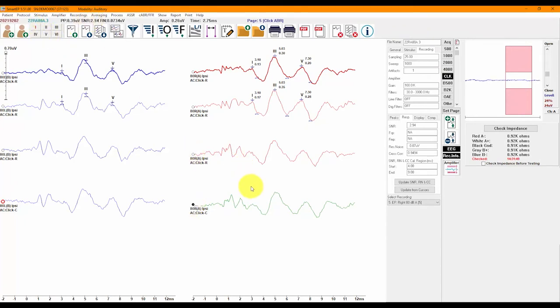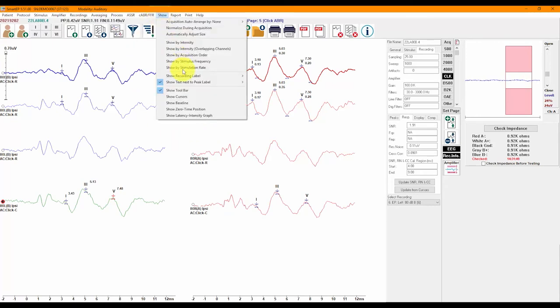When testing infants, it is not uncommon to test one ear first going through all frequencies, then proceeding to the other ear. Using this feature, you can easily move the right ear recordings to the corresponding pages first, then switch to the left ear and send those recordings to their pages. You will have the recordings arranged with the right ear recordings on one side and left ear recordings on the other, making report preparation a smooth process.